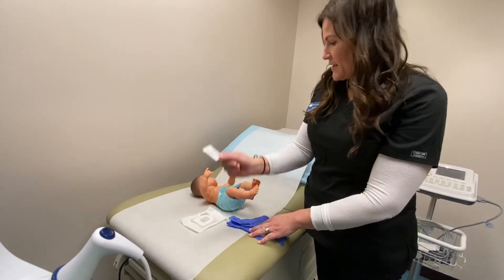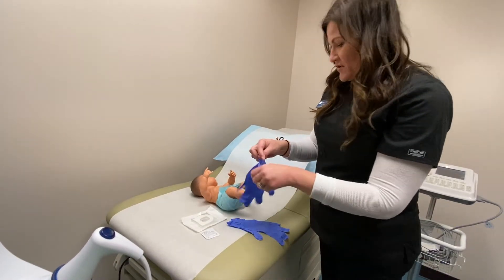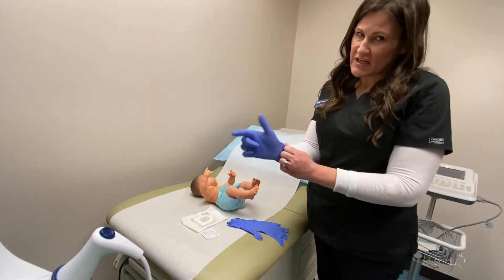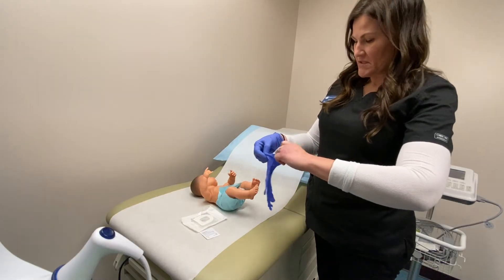And then you're going to need the towelette to cleanse the baby. Wash your hands first, and then put gloves on.